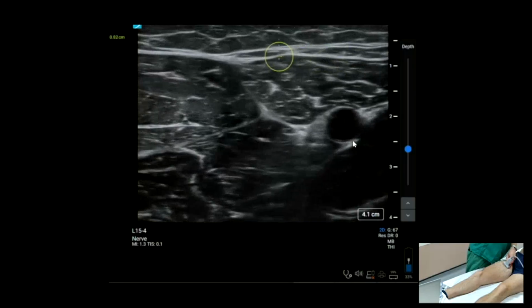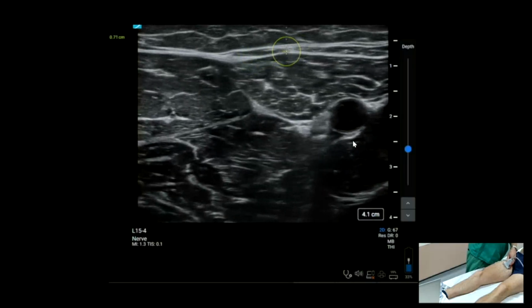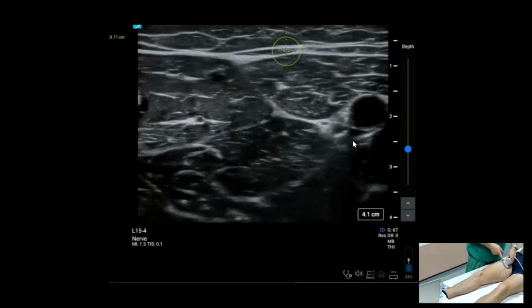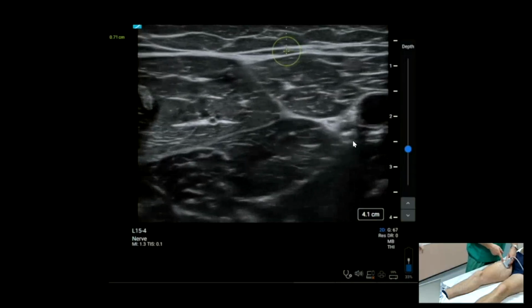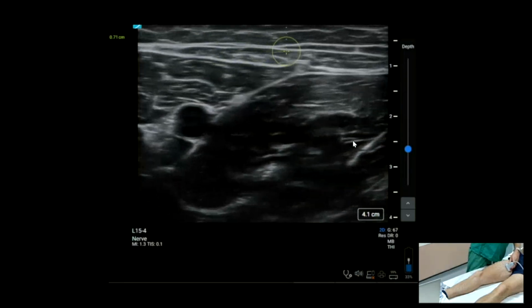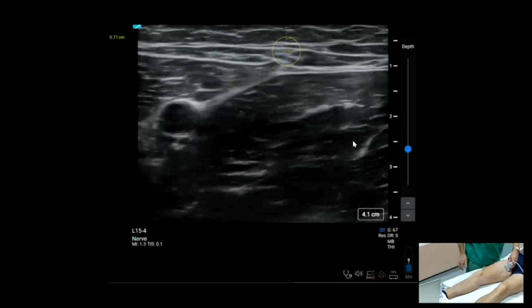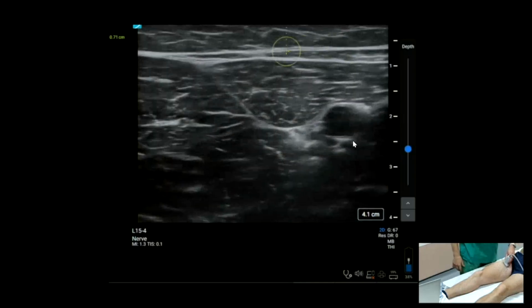But you would come into this plane, even if you couldn't see them, and there's maybe something here, you'd infiltrate, bring your needle in from the lateral aspect, and I'd aim to basically, using an 80mm needle, bring it along here, this plane, and target the structures that look like little white hyperechoic structures. And you sometimes do that with your femoral triangle block at the same time?